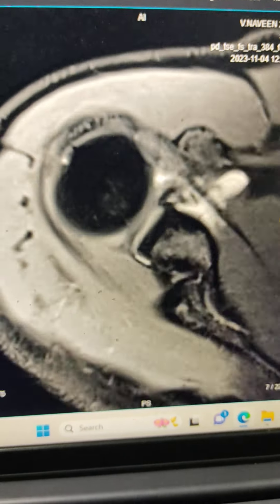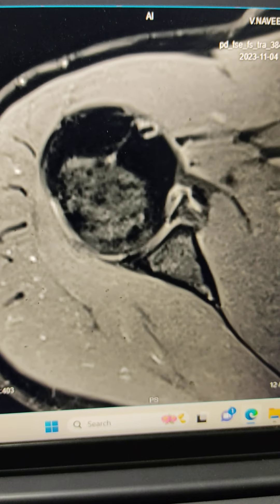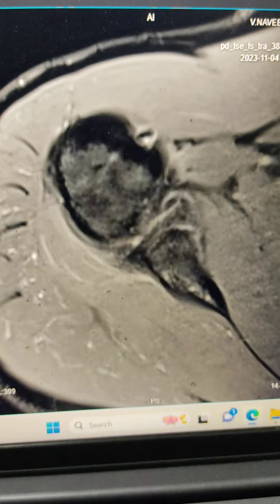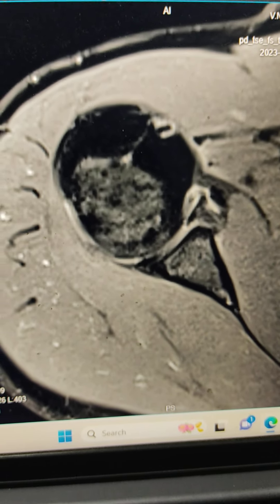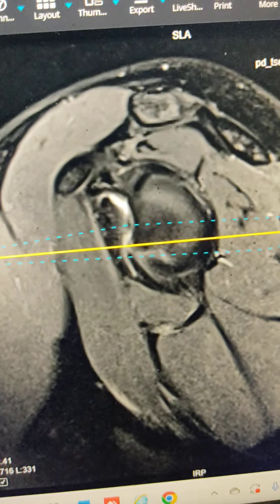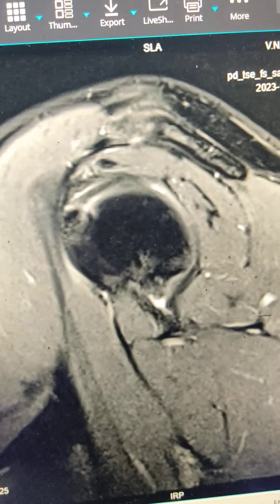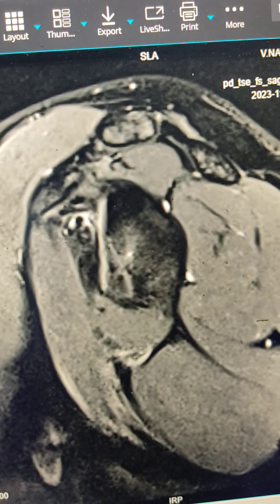There is no Hill-Sachs lesion seen, so it could mostly be a Bankart or Perthes lesion — we can consider it as a differential diagnosis. To correlate on the corresponding sagittal sequence, the labrum is uplifted here.